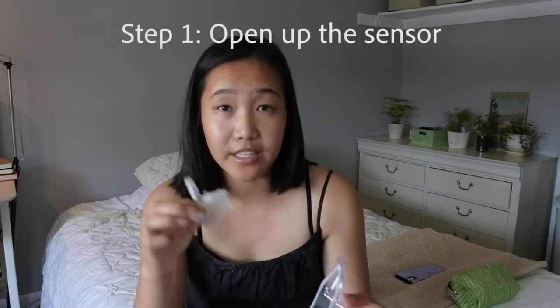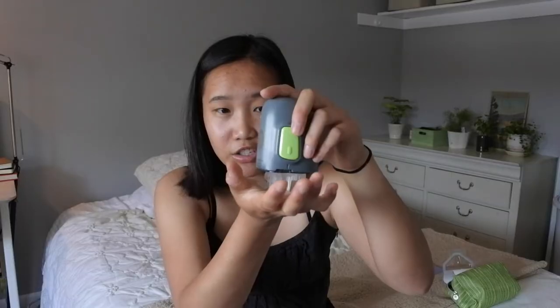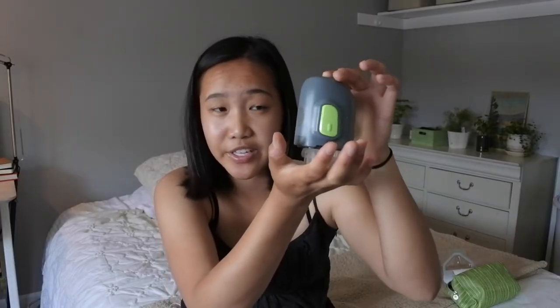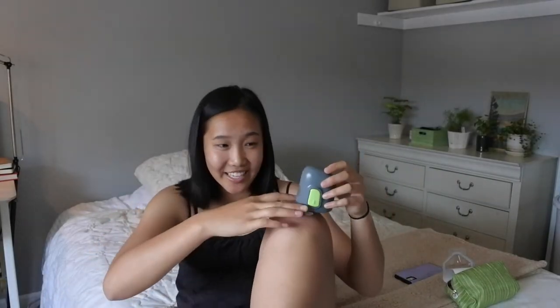First, you're going to remove the Guardian from the case and insert it into the inserter. You should use a flat surface — I'm just going to use my hand — and push it down until you hear a click. Then get a flat surface, remove it, and what you'll end up with is this.